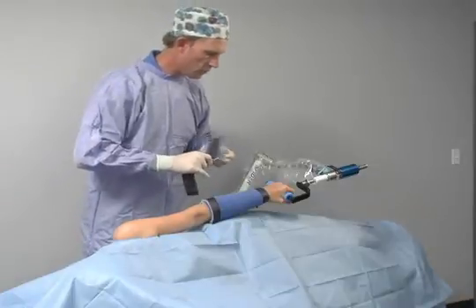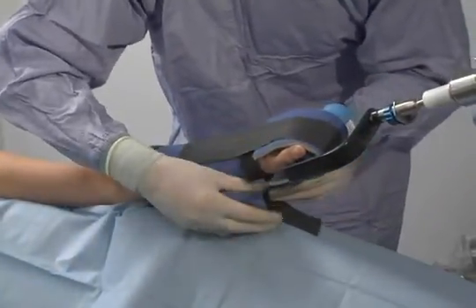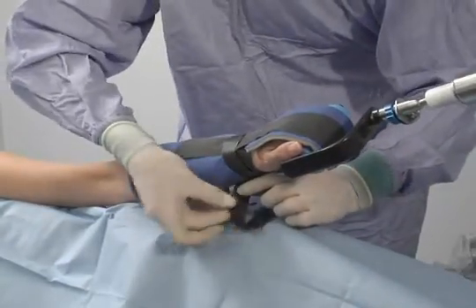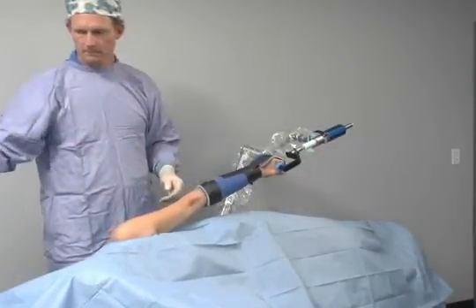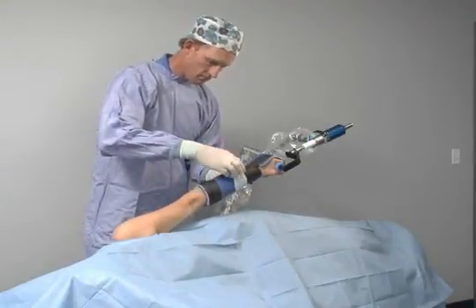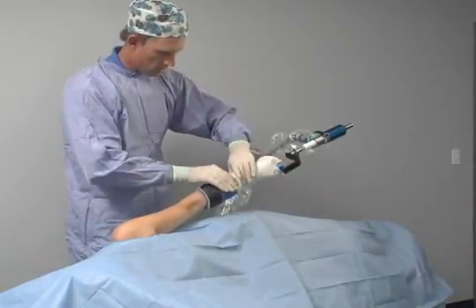Take the handcuff and wrap it from the back of the hand around to the front side of the forearm. It is important to have the hand held securely by this wrap. After the handcuff is in place, wrap the long velcro straps around the wrist and forearm — it is critical to have the velcro straps wrapped securely. Lastly, the arm can be wrapped with a tensor bandage or Coban wrap.